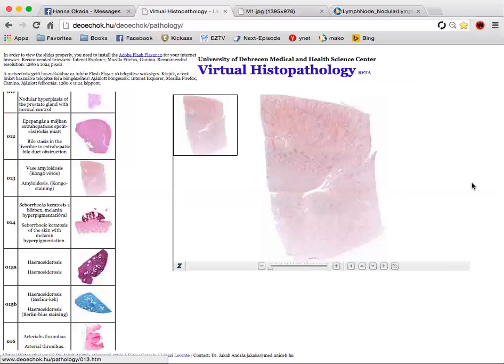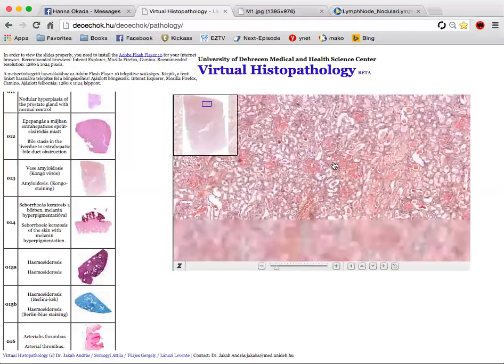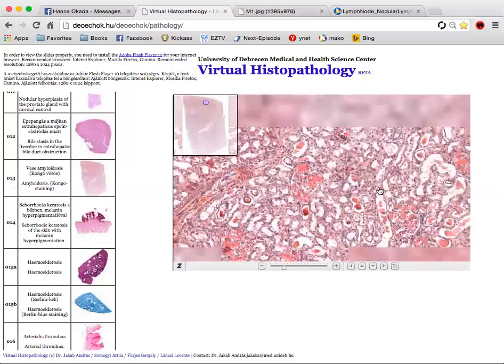Yeah, so you can say that this is a slide of amyloidosis in the kidney, but you would have to see it under polarized light. Okay. So what you can see here is that this is the cortex, and this is the medulla. And we're going to go to the cortex because the amyloid substance accumulates in the glomeruli and in the wall of afferent arterioles.